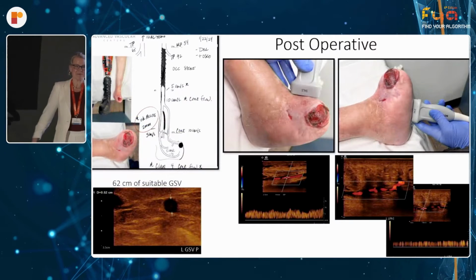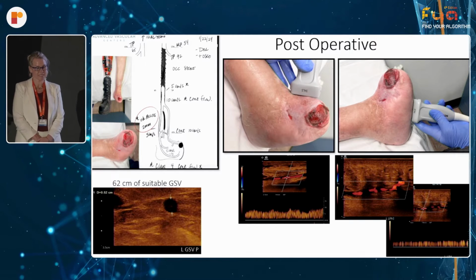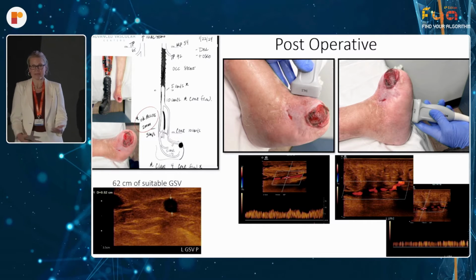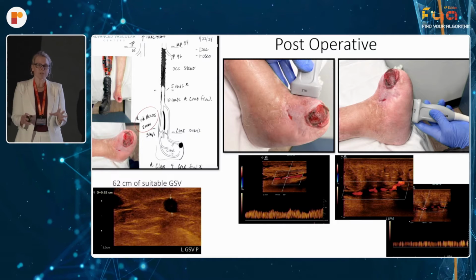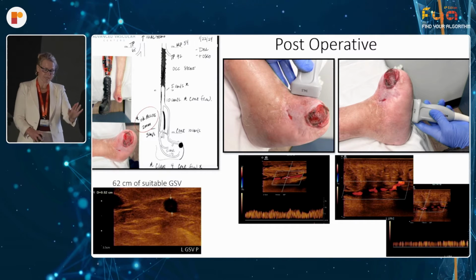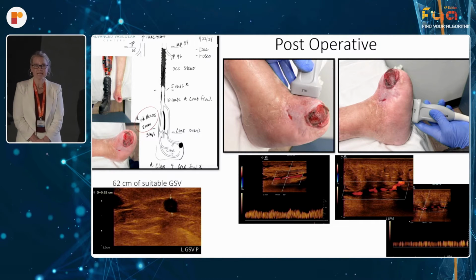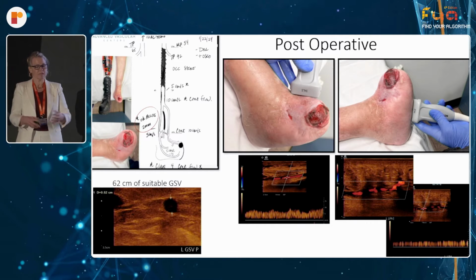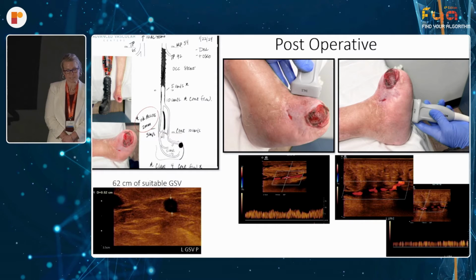So this is a great example of a patient that I just saw last week. Previously did his SFA stenting. What would you use for this patient? He can't do a TBI, of course. We can use TCPO2. Yeah, we could do ABIs, but we really want to know what the status of the pedal arch is to this wound. So obviously it is Class 4. He needs to be revascularized. He's got 2-vessel runoff, but he also has a nice great saphenous vein, distal target for distal pedal bypass. So we can plan a lot and understand further treatment of the care of these patients.